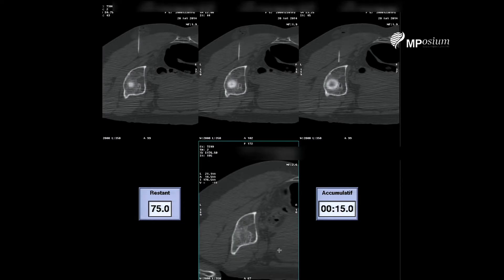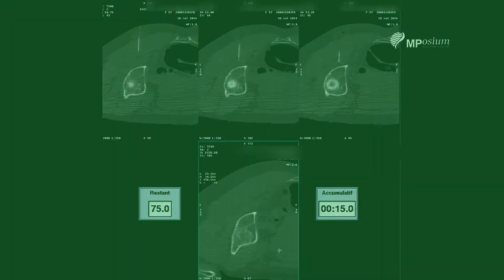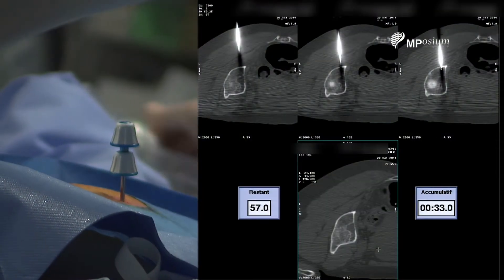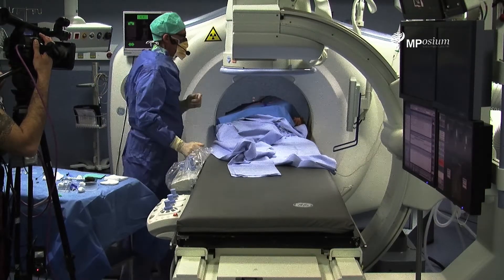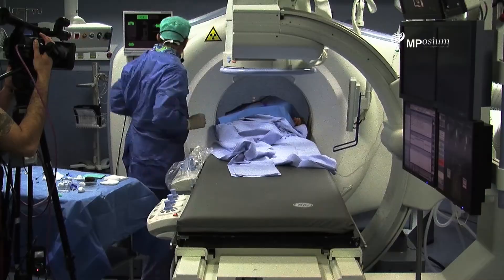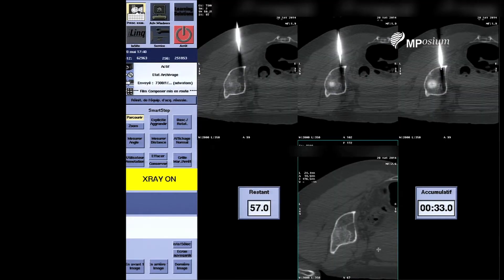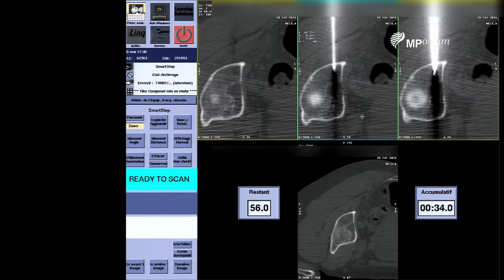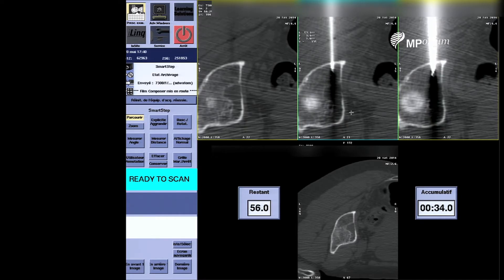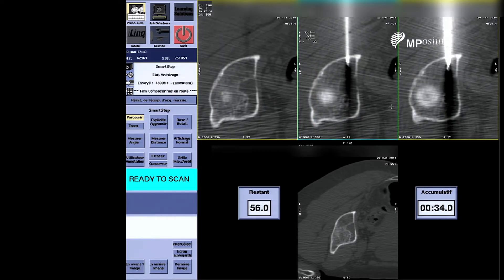We are very close to the bone cortex. I am pushing the cannula over the drill and drilling again. We can see we are getting closer and closer to the target.